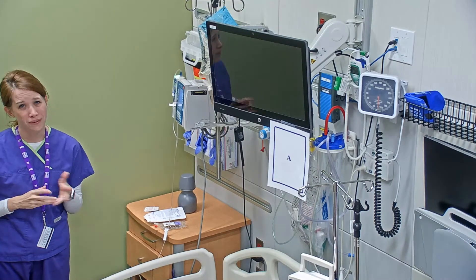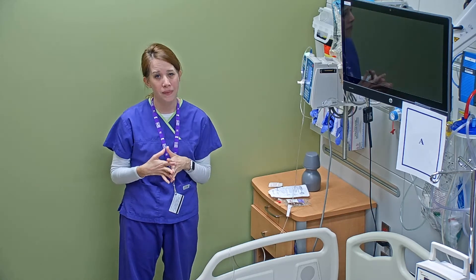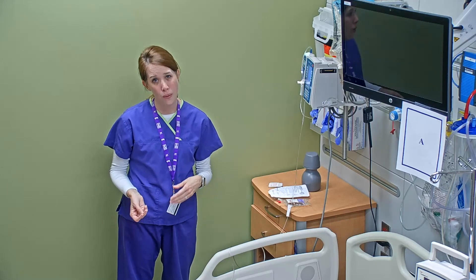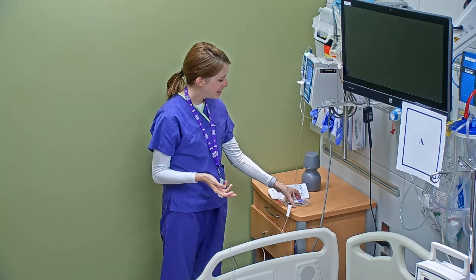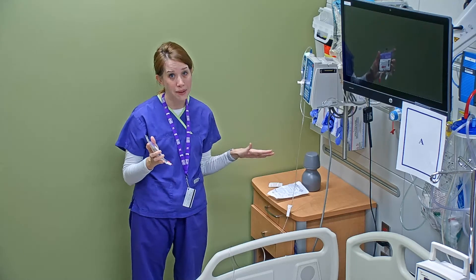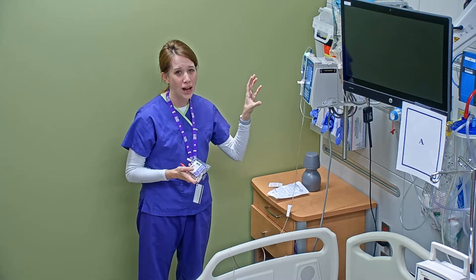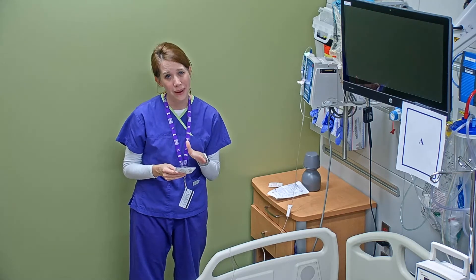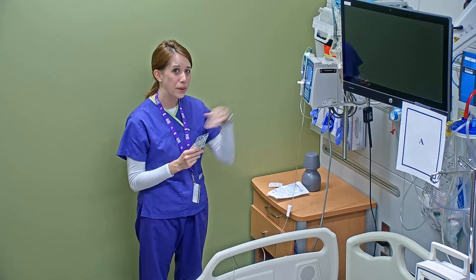Now I'm going to show you the forward priming method. This is really a choice that nurses get to make — they either choose to do back prime or forward prime. Because a lot of the nurses you work with in a clinical setting have more experience, you may see them doing the forward prime method because they perceive it's a little bit faster to get the medications up. The basic idea of forward priming an IV piggyback is that you're using the fluid within the secondary bag to prime the tubing, and you can do all of that before you even get it connected to the IV pump.